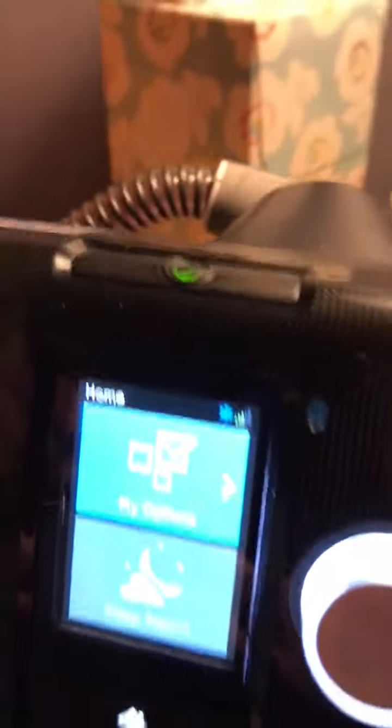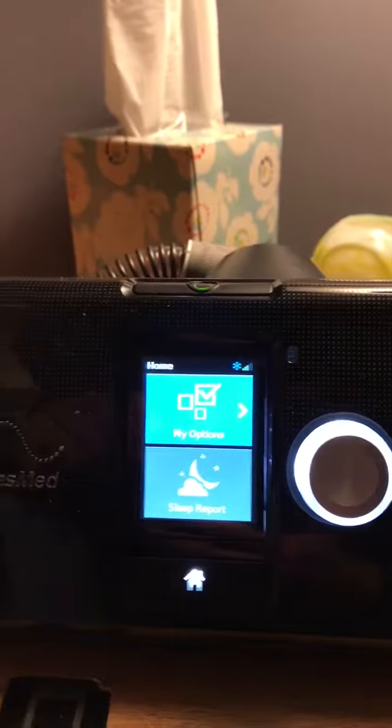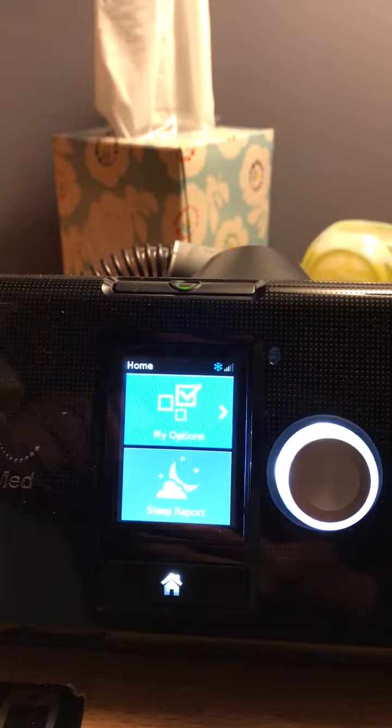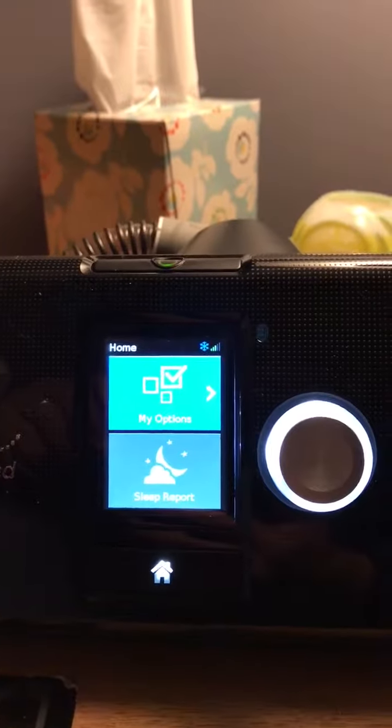Hello, I'm making a video to show how to change the startup pressure when you first turn on your ResMed 10. Mine was at 5 and I felt like I couldn't breathe right and I felt a little claustrophobic.